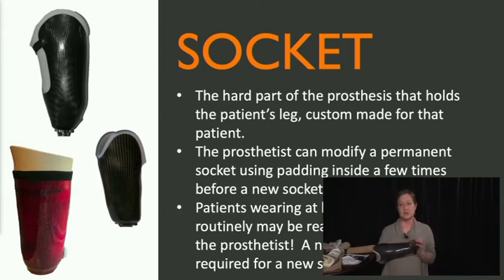If the patient is ready for a new socket, that does require a physician's order and insurance approval, and we as therapists can help with that. Our documentation can also help with that. In the assessment, we should be saying, this socket doesn't appear to be fitting anymore because of this, this, and this. Patient has pain with ambulation. We've added socks. It's not resolving the issue. And it's time potentially for a new socket, and then you refer back to the prosthetist. So I think that's really important for our documentation to support what the prosthetist is doing and what the patient needs.